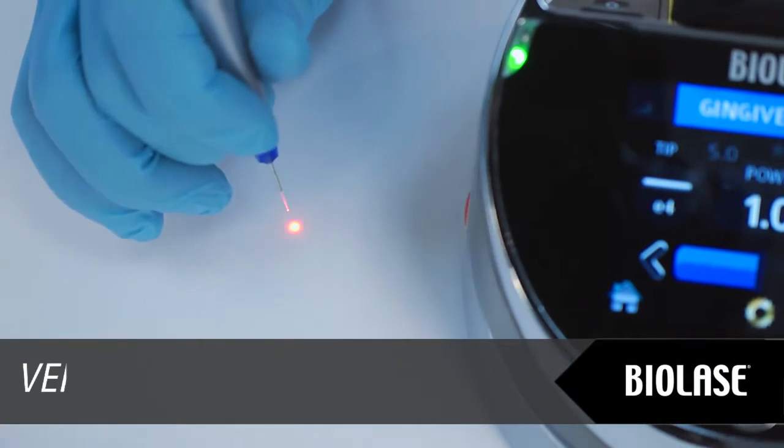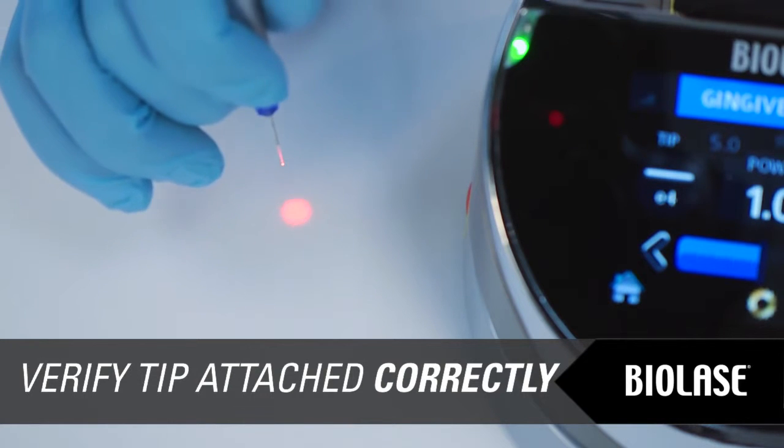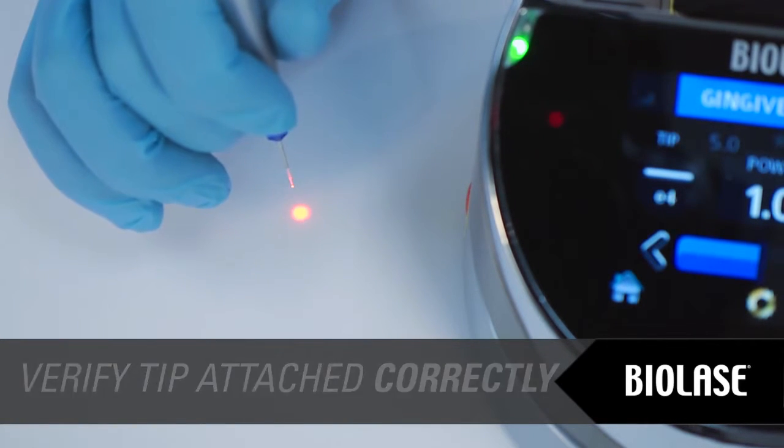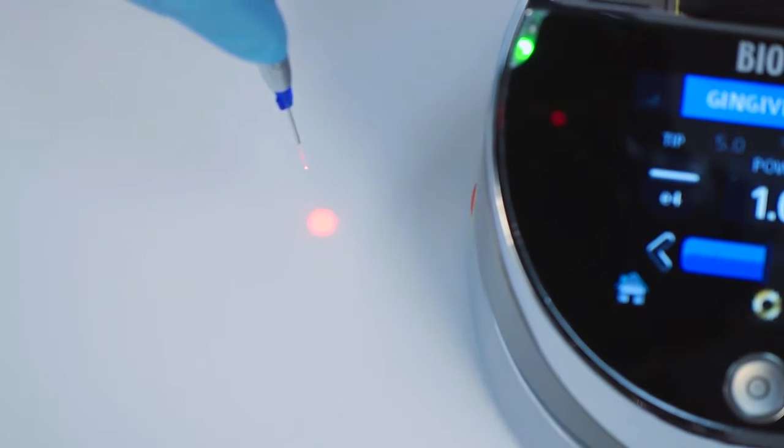To check if the tip is properly attached, shine the aiming beam from a straight tip without pressing the foot switch onto a surface such as a tabletop. If the red aiming beam makes a pattern of a circle, the tip is connected properly.